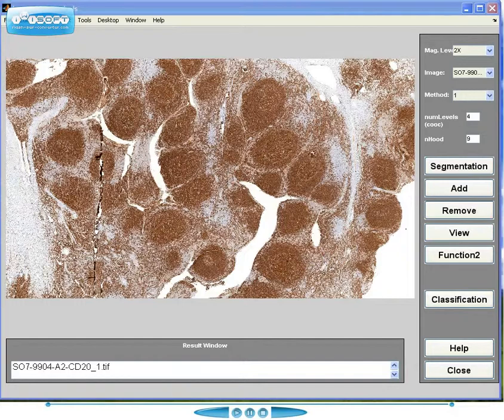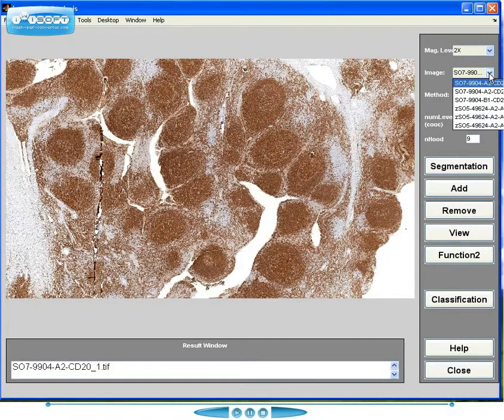Unfortunately, manual counting of centroblasts suffers from inter and intra variations and sampling bias. Also, selecting the representative follicles is subject to sampling bias. We are developing a computer-assisted grading system for follicular lymphoma. The detection of follicles from the IHC stained and digitized follicular lymphoma tissue slides is one of the steps of a computerized system. This user interface allows selecting the ROI images captured at different magnifications.